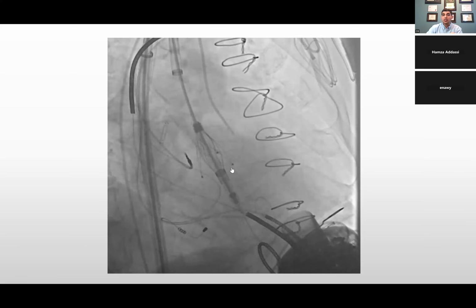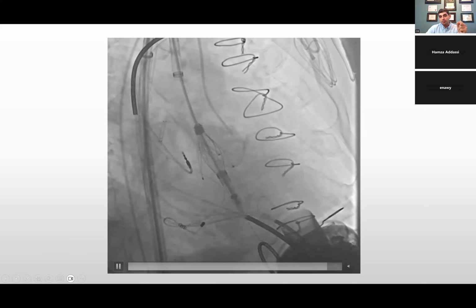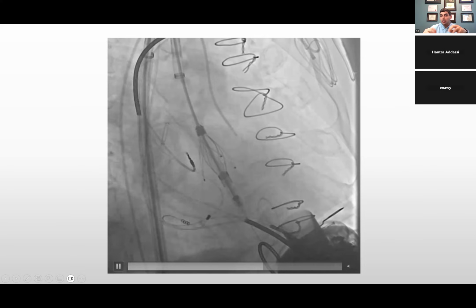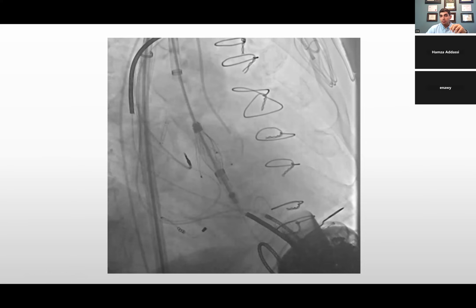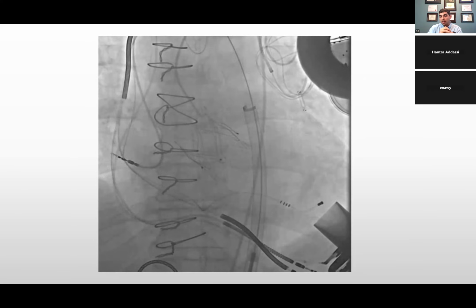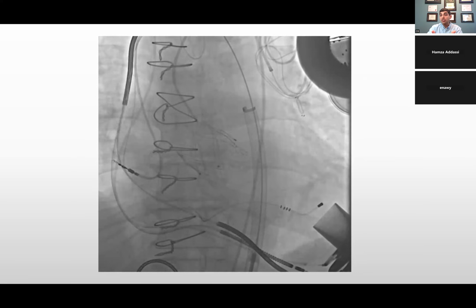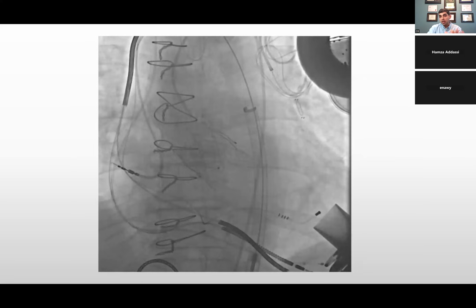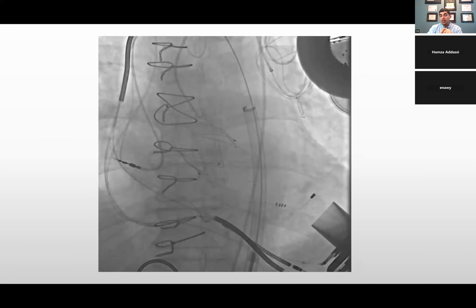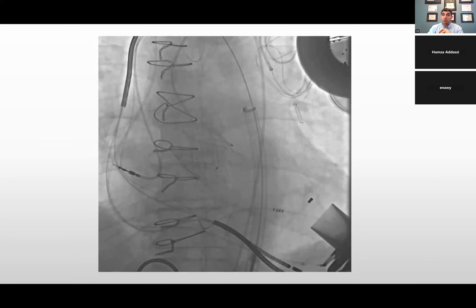And so they had to create these little hooks. You see three of them that will anchor on the cusp. And once they put them into the cusp, you can deploy a valve. This is called the Jenna valve. It was FDA approved only four months ago, after the testing and everything. And that's another option that structural cardiologists have.